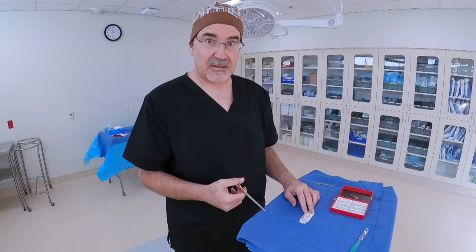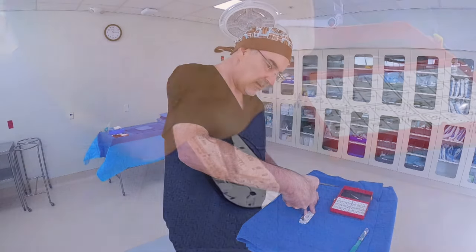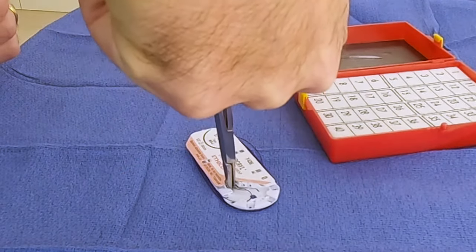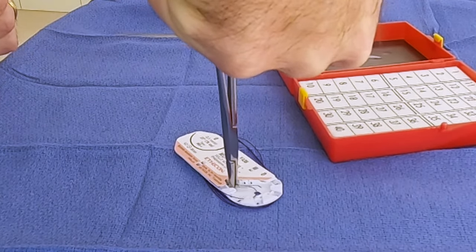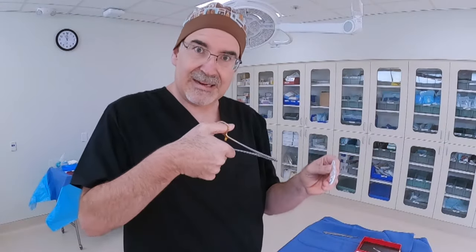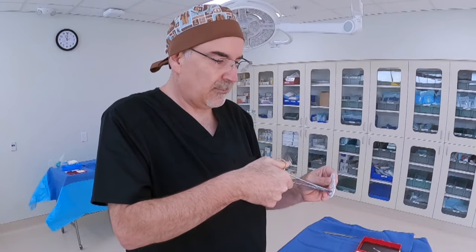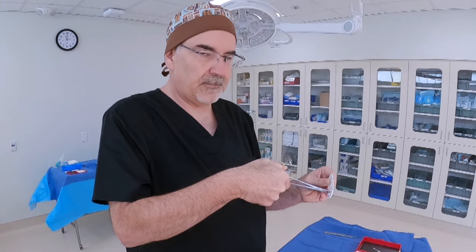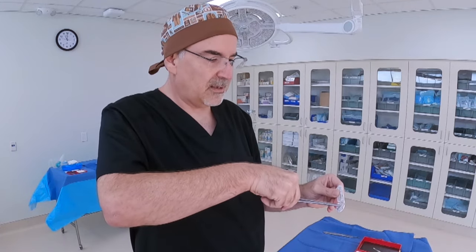If the packet is on the table, I'm going to come straight down at it, grabbing at that quarter to a third of the way around the needle and clamping on at that point. If I'm holding the packet in my hand, I'm going to come in at a 90-degree angle from that packet, come straight in, and clamp on to the needle. From there I can twist and pull the rest of the needle out of the packet.